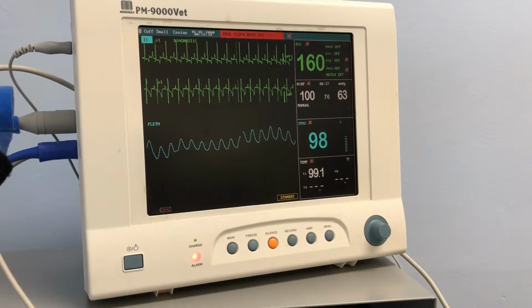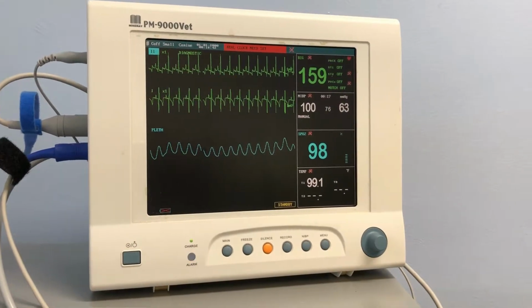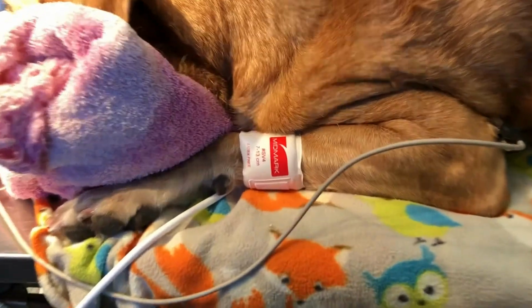My machine that you see us using in the video is an oscillometric. I'm not sure if I'm saying that right. Basically I just put the cuff on the patient, and it uses an internal pressure sensing bladder to blow up the cuff, measure the pressure, and then send it back to the machine that we were using.